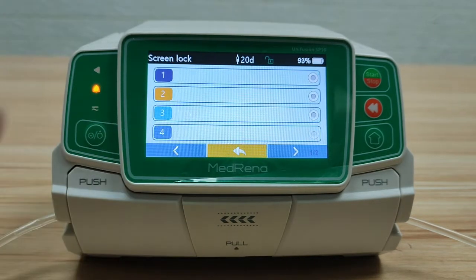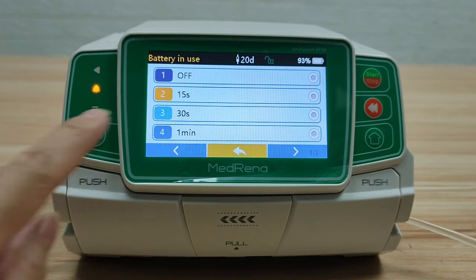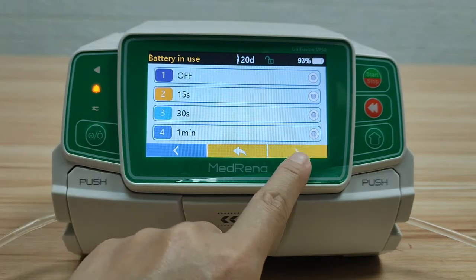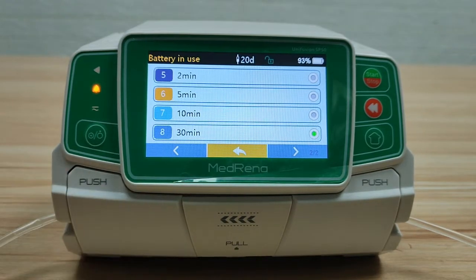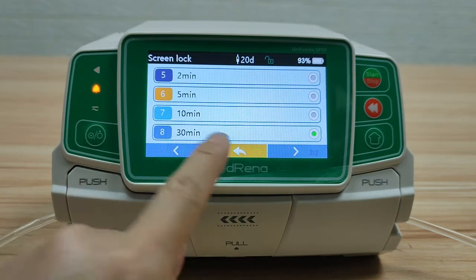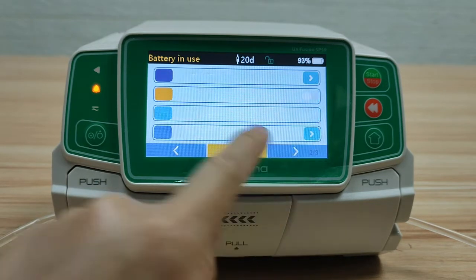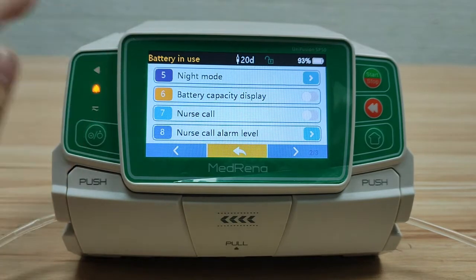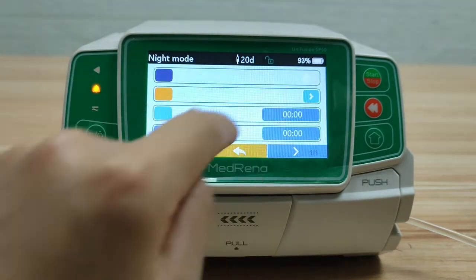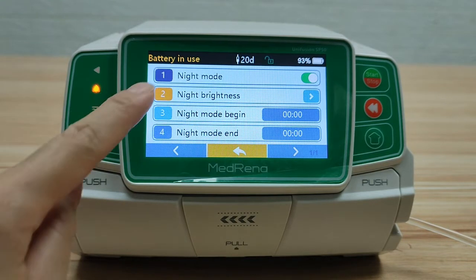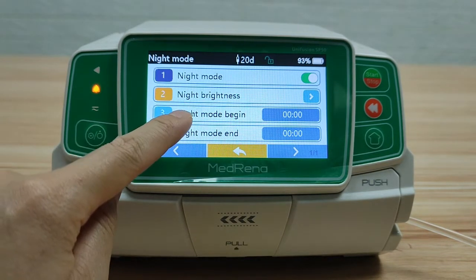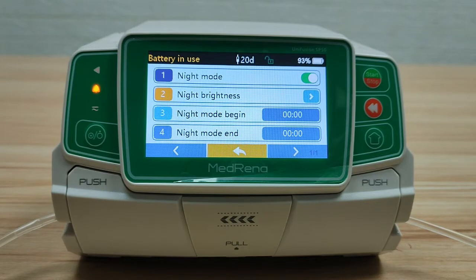Screen lock: choose how long you would like to lock the screen, from 15 seconds to 30 minutes. This is to avoid unintentional or improper operation. Night mode: choose it on or off. When it is on, choose the night brightness and the time set for the night mode.